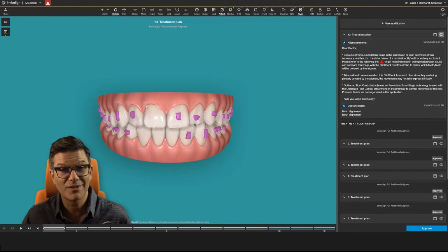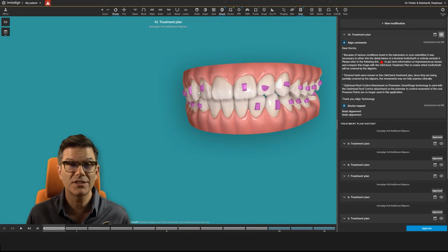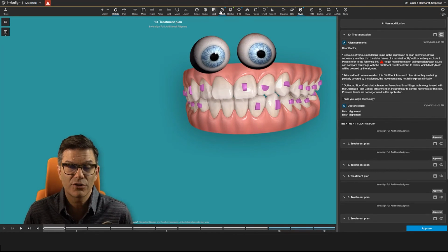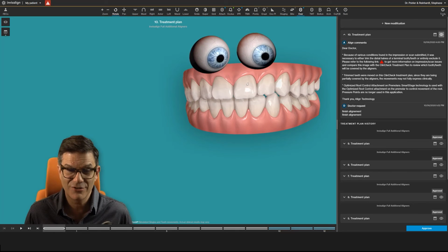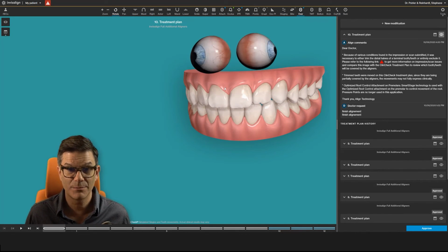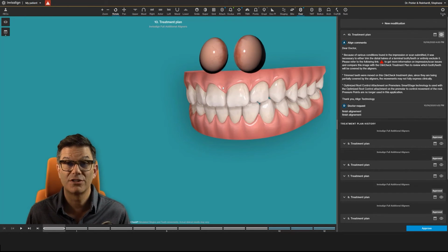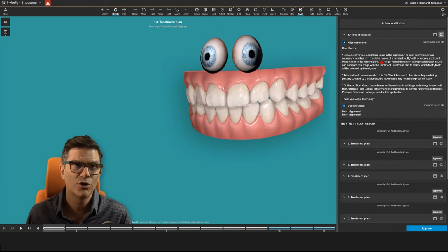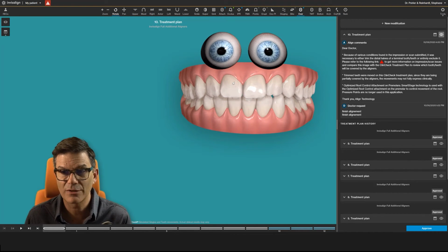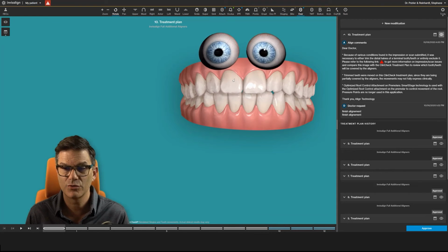What you have to do now is use it and try things, and nothing's gonna explode. This is how you're gonna learn. You have to put your hands in it. There's a learning curve. Sometimes it's intimidating when we're starting. There's a lot of things, but even if you do courses and courses and courses, at one point you have to put your hands in it. You have to try it.